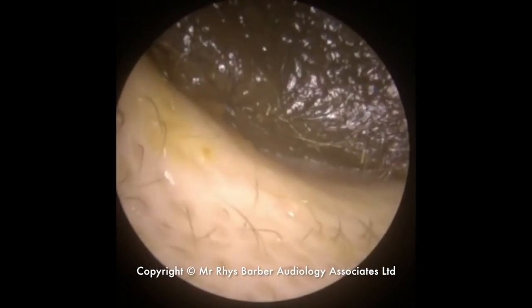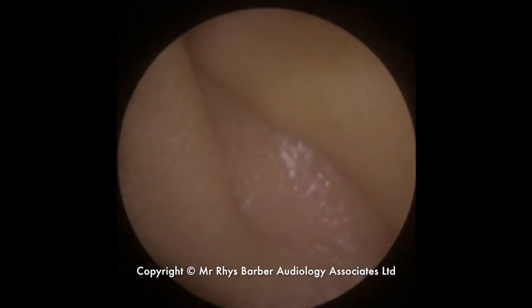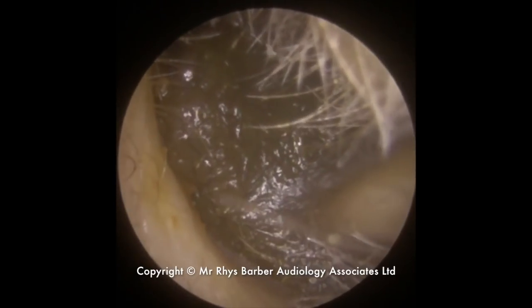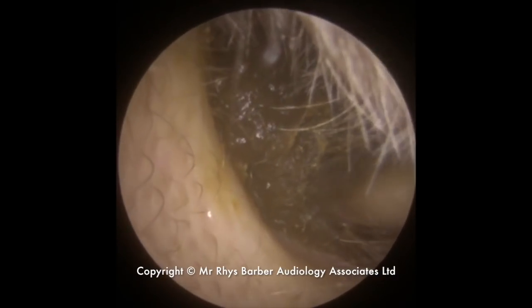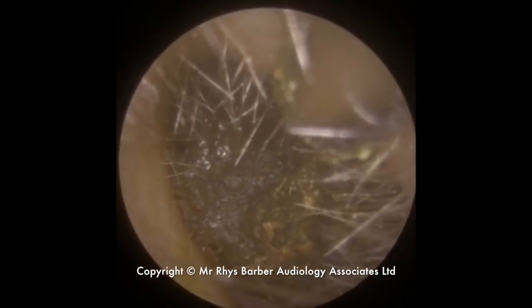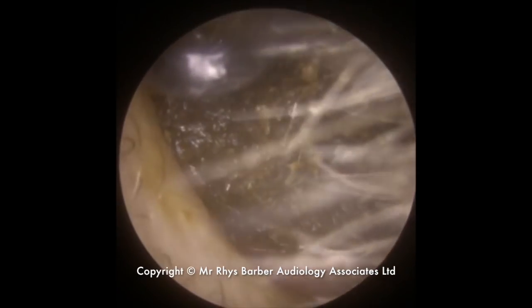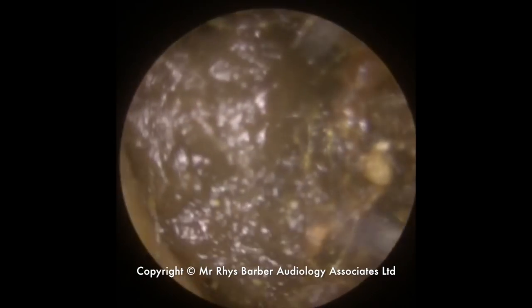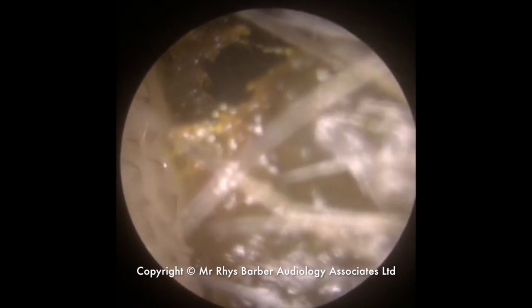You can see a little bit of redness around the ear canal there from manoeuvring this down. Now a very similar story on the other side. You can see we've got a gap at the top of the wax there — the front end looks quite shiny, so it's always difficult to tell whether that's hardened or sticky wax. We're going to use some suction here. It looks a little bit harder than the other side, doing the same process, just trying to lift from the base of the canal. But it doesn't look like it's going to budge. The base of the wax nearest the canal walls is quite hardened up, whereas the top is very soft and sticky.